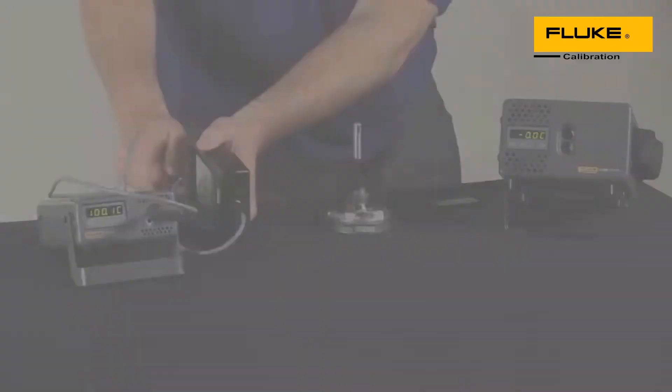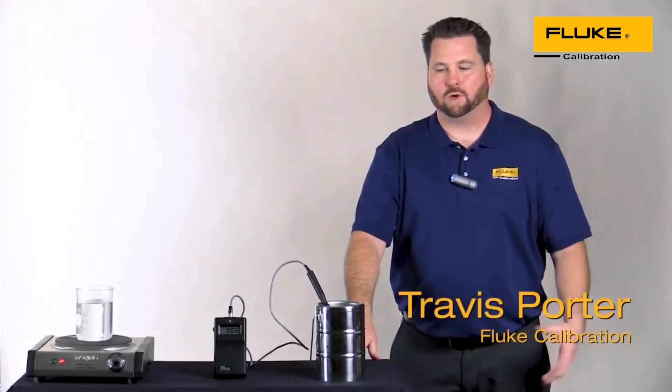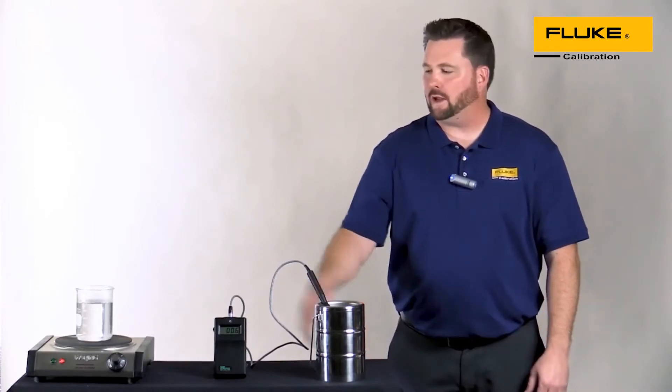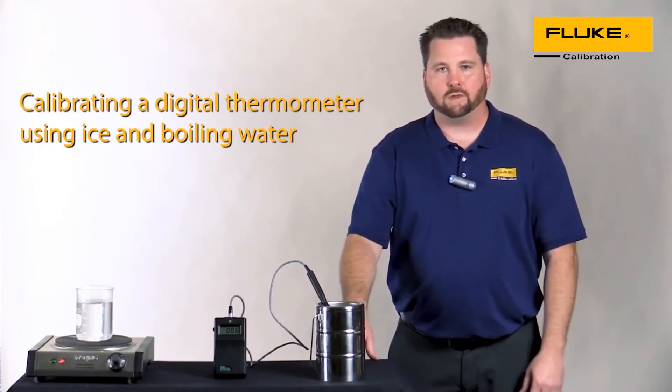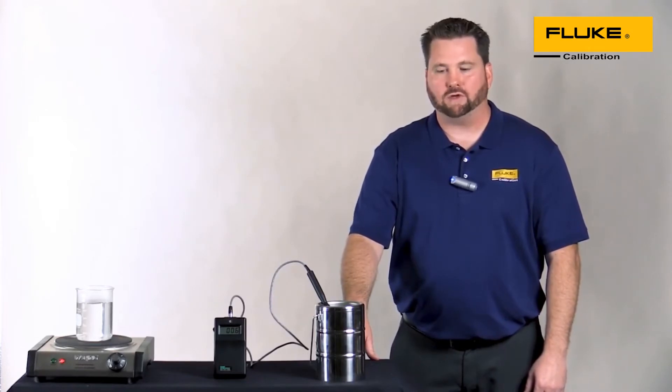Let's experiment with a couple of different calibration methods. We're going to use the common methods of ice water and boiling water. I've got everything set up here — we'll do a quick check with these and then compare against our dry wells to see how we measure up.